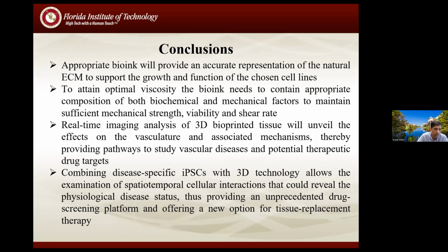So in a sense, what we really want to emphasize is that appropriate bioink is very critical, including mixing with the cells for the development of your structure, and the viscosity of the bioink is important. One of the applications we are looking at is space. As you know, there are a lot of spaceflight implementation partners. Once we go into space, they have microscope-based systems where they can monitor the cells, because it has to be an autonomous process. One of the things is how you can develop an autonomous process to monitor all of these things, because astronaut time is going to be very busy, so we have to make it more autonomous. That's the reason tissue chip autonomy is one of the key buzzwords NASA is looking at.